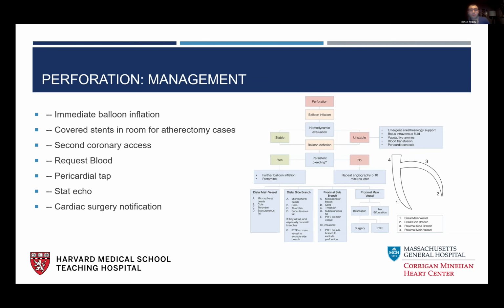And the other thing is, I also recently learned that when you inflate the Papyrus to more than 14 atmospheres, the edge itself can cause more perforation of the vessel, especially if the vessel is so fragile after atherectomy. So I've learned to deliver the Papyrus at low atmospheres, and then when you have everything ready, you can post-dilate it. Any thoughts on high pressure inflation of Papyrus?